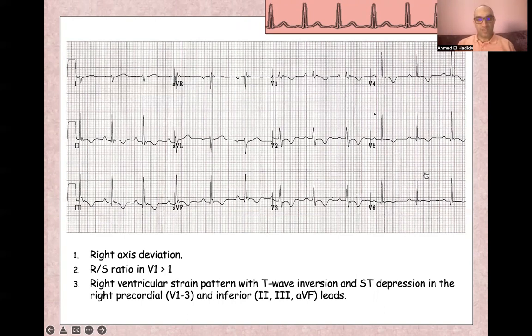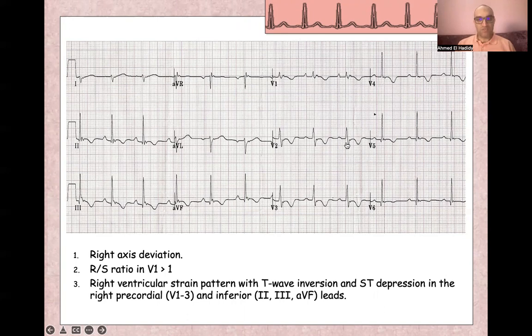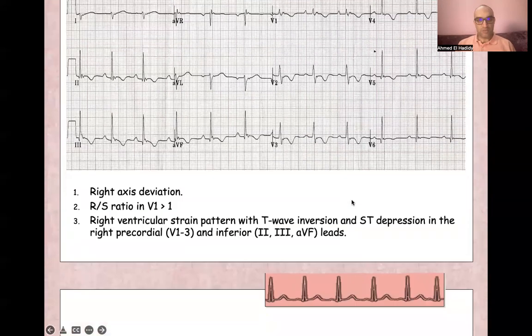Here, there is no dominant S wave in V6, but you will also find right ventricular strain pattern with T wave inversion and ST depression.